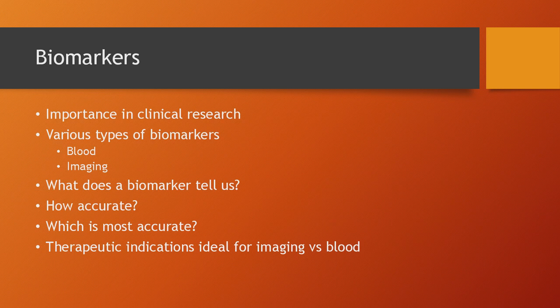But if we quantify the gray matter volume, if we quantify the white matter volume in the entorhinal cortex of the hippocampus, then we can identify, for example, that we have a loss of gray matter in this region, right? And we can only do that if we quantify by computational imaging techniques and computational analysis techniques the findings in the images, and we try to provide a quantitative support to the naked eye.